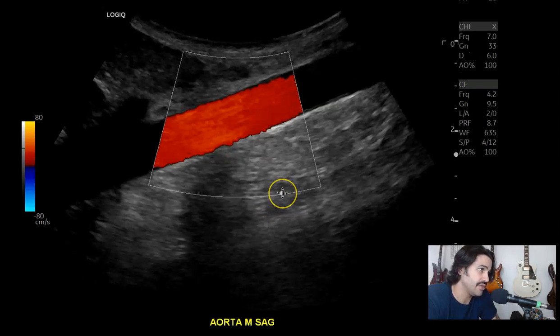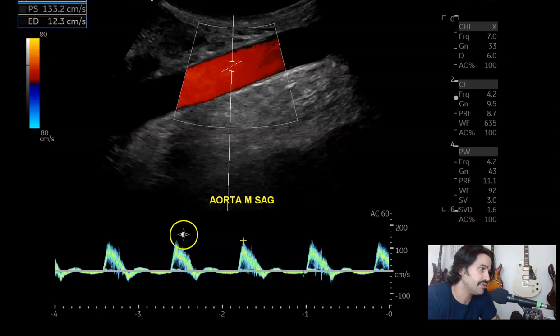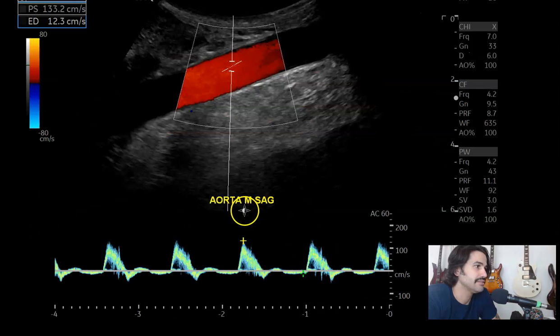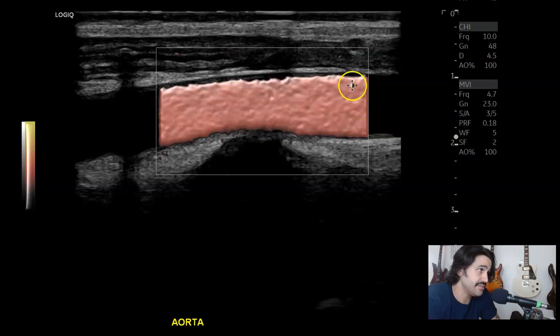So then mid sagittal with color and with spectral Doppler — again, nice triphasic waveform. I also like to make sure that the scale settings are right to reduce aliasing, and that the gain is low enough so you don't have a whole bunch of background noise. Here's a linear image of the mid aorta. You can see the vertebrae and the intervertebral disc spaces. This is with MVI — microvascular imaging. Beautiful stuff.